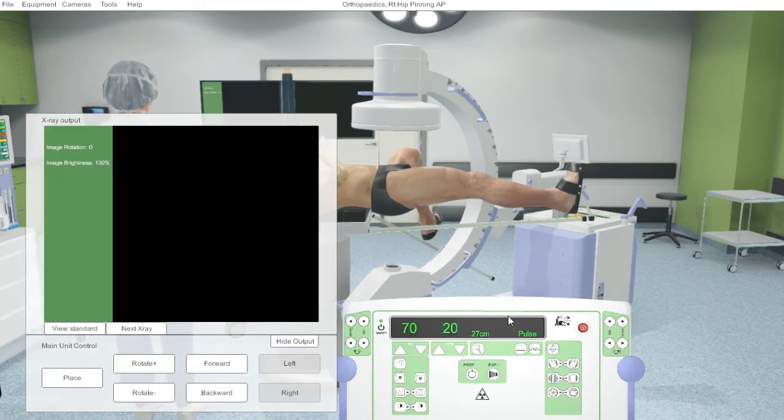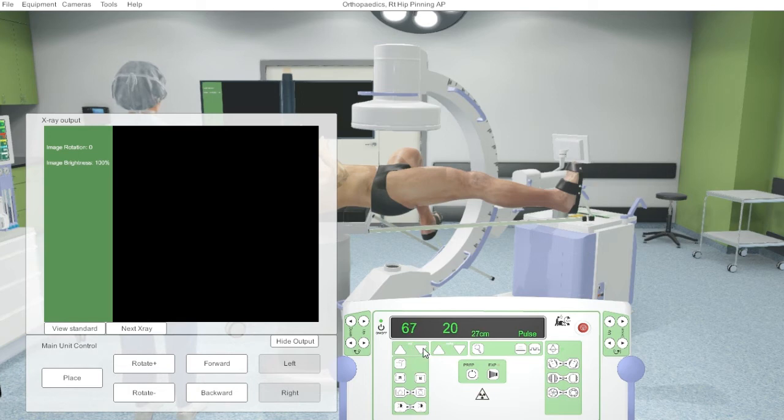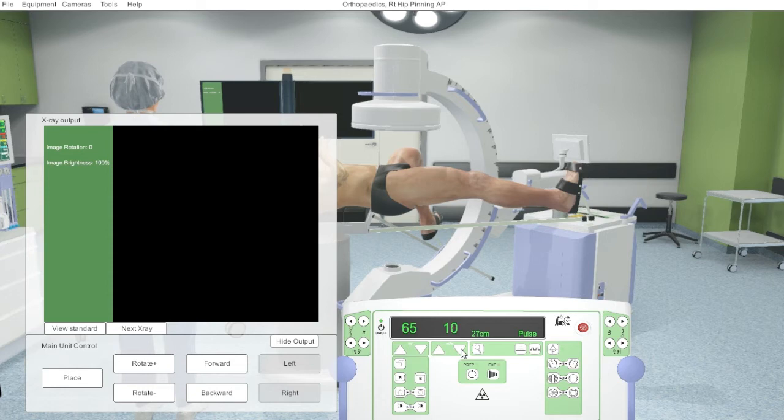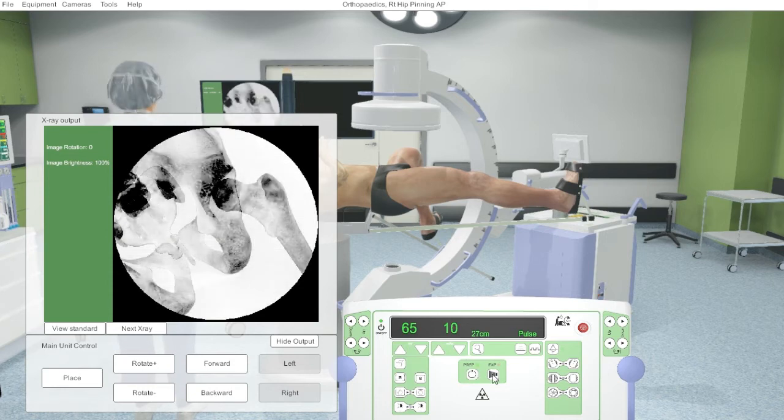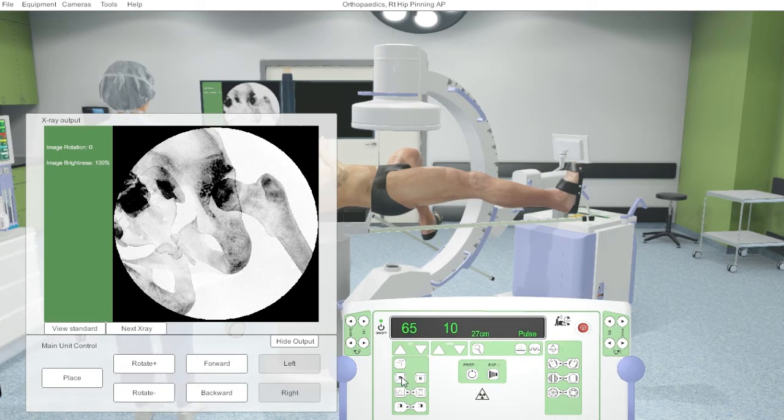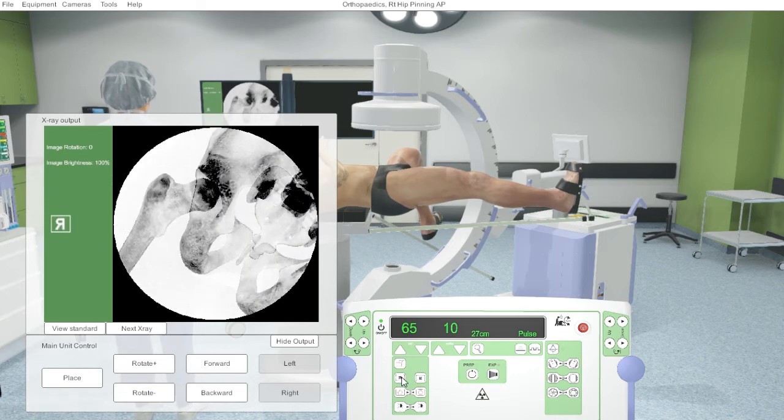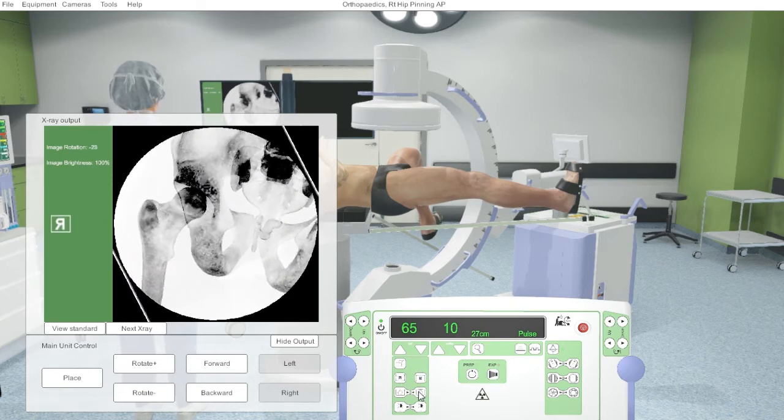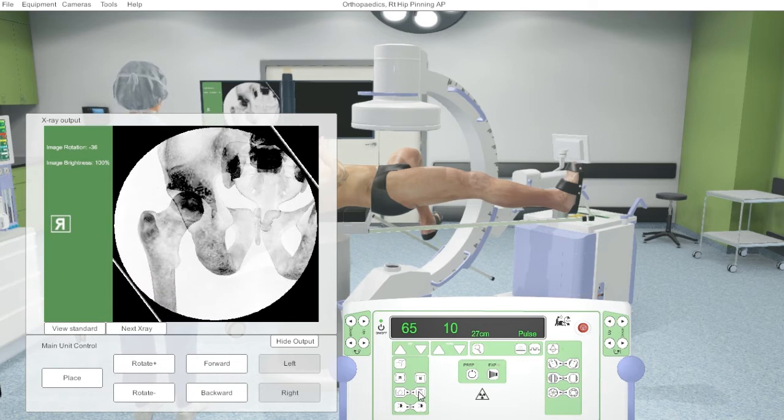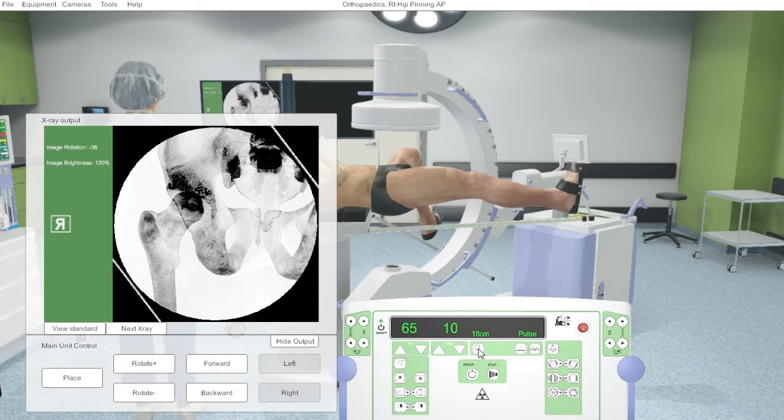We can manipulate the exposure factors. We do not have an in-built AEC for this equipment. And take an image. We are able to flip the image, rotate the image on the monitor, and change the zoom or the magnification factors.